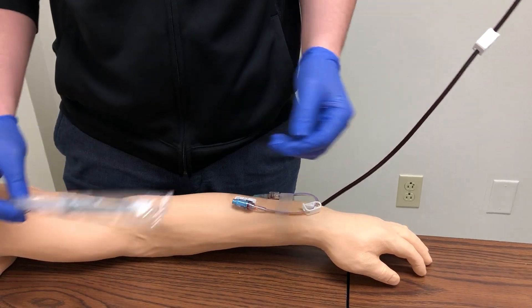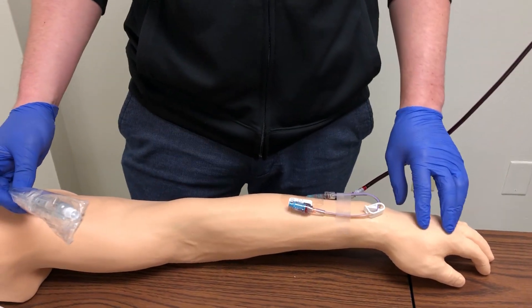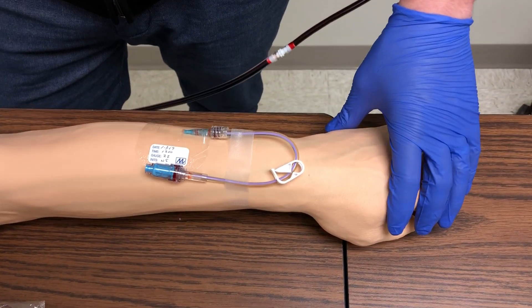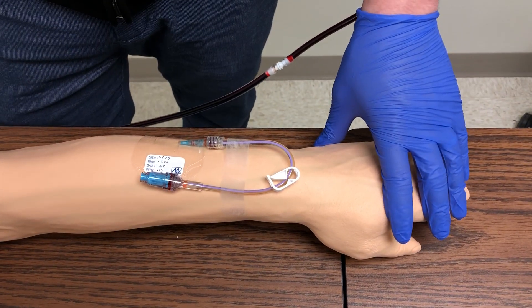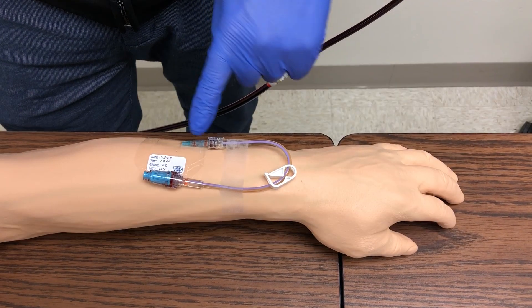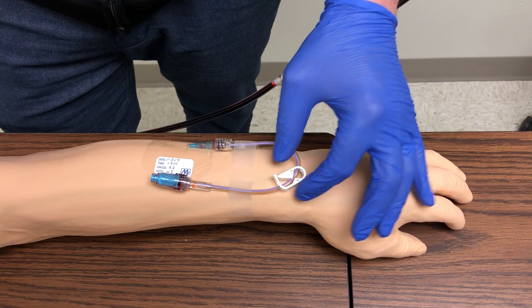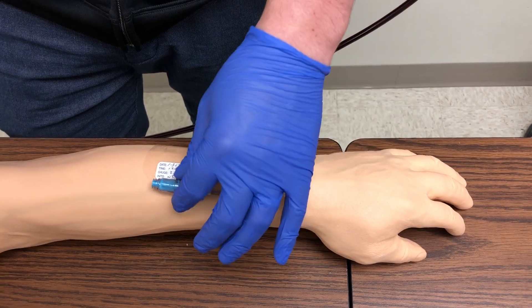We're going to do a demonstration on a saline flush for a saline lock or IV lock. This is what you should be looking for when assessing an IV to perform your saline flush. You're going to have your IV catheter here connected by the J-loop with the lock connected and your injection cap.